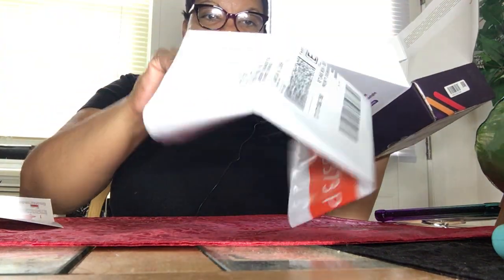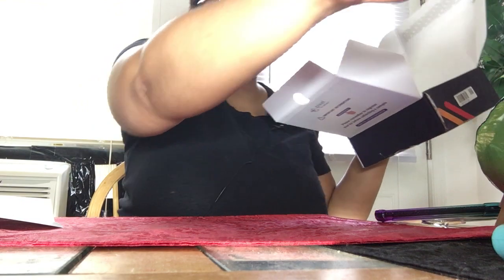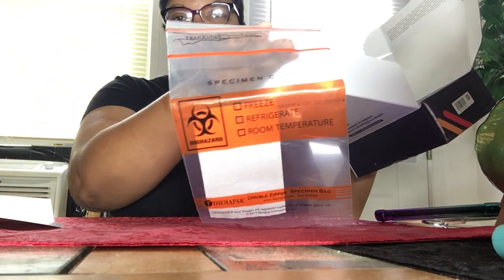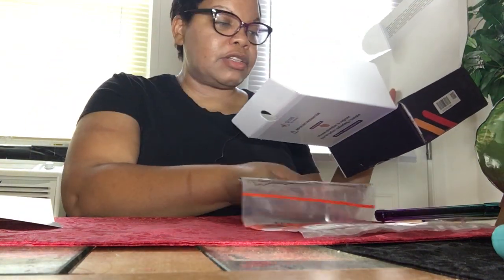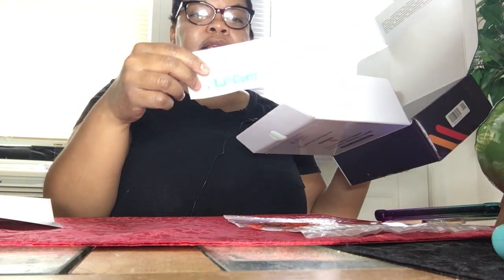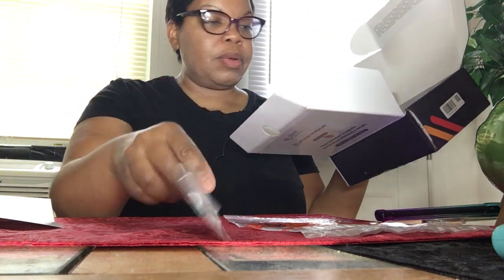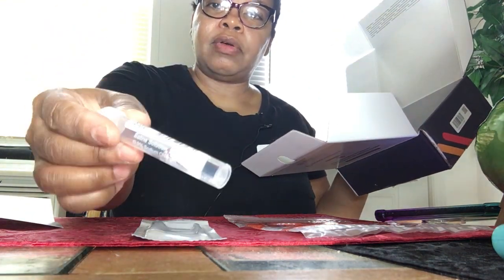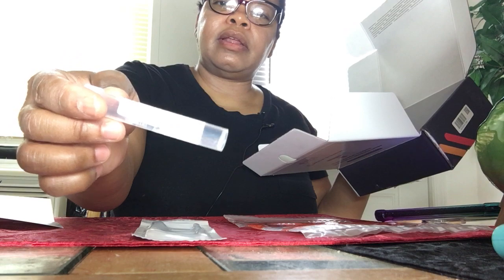Everything has to go back in this box, and this is the huge envelope they want the box to go into. This is the specimen bag, the biohazard bag, this is the nose swab, and this is the vial with the liquid in it.